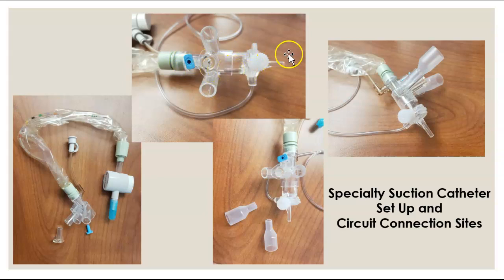Okay. This is the end where the endotracheal tube, we take the hub off, place that directly to the end of the endotracheal tube. And then we have these two ports. They will be too small for you to direct. So on your Draeger circuit, you'll take the Y piece off so you have just the two circuits loose. These are too small. So for that continuous flow and PEEP delivery, these come with the Draeger circuits. They're a specialty adapter that will come with it in a little baggie. These attach onto here and then onto the end of your circuit to allow it to fit.